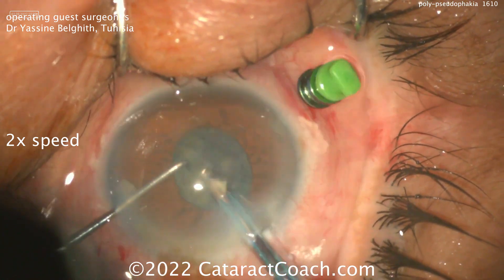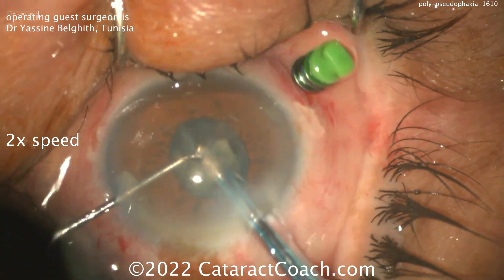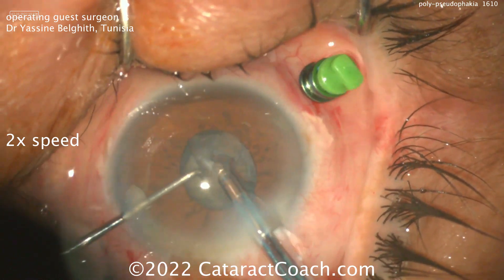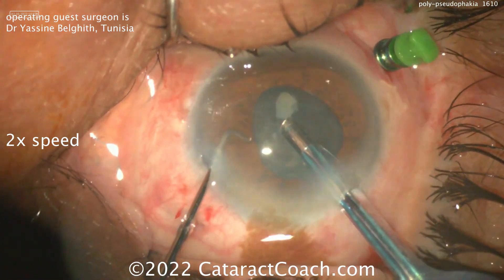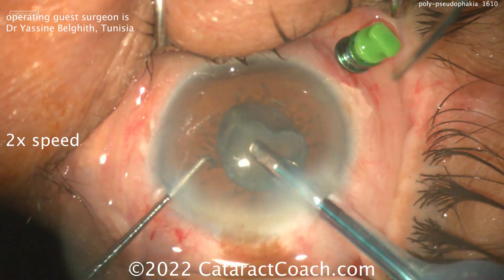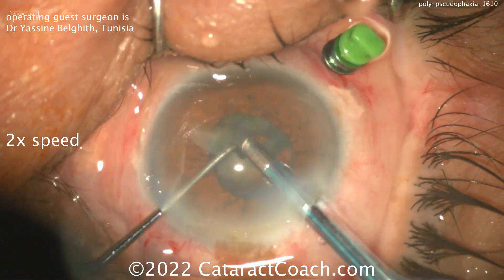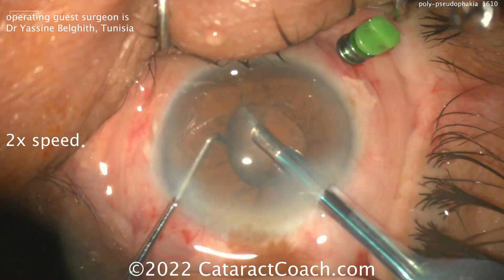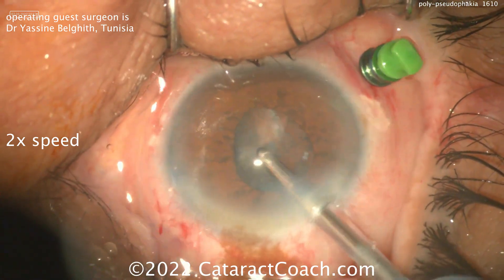The answer is it's easier with a shallow AC. If you have a patient with a 16-millimeter axial length and a normal or deep anterior chamber, the effective lens position is so far posterior that the IOL power increases dramatically. So in a case like this, you'd want a shallow AC of about one-and-a-half millimeters or less for more accurate lens calculations. In the USA, the highest available IOL power is 40.0 diopters — a single-piece acrylic monofocal lens — but what if the lens calculations come out higher than that?